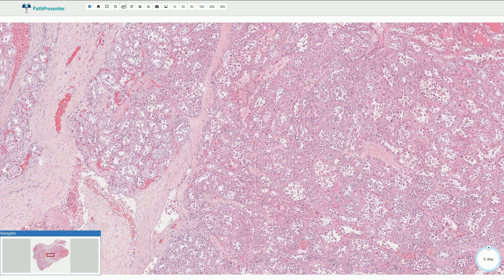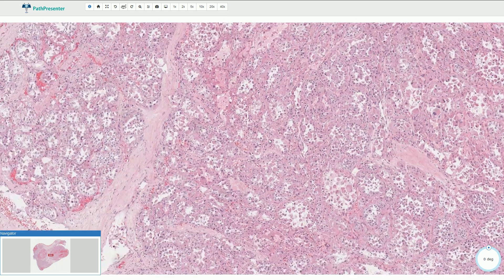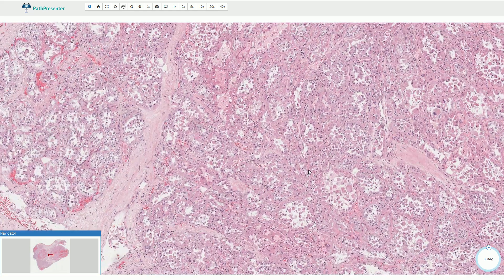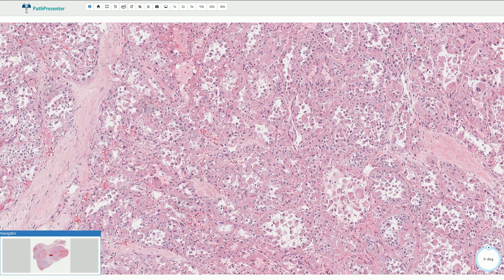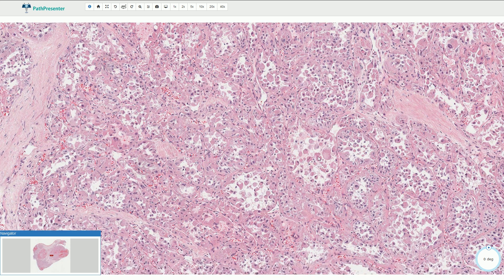On higher magnification we can see that the tumor has a very typical histological appearance. It is typically described as a pseudo-alveolar arrangement. The tumor is composed of tightly packed cellular nests.